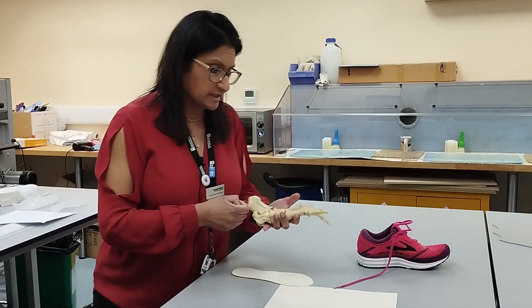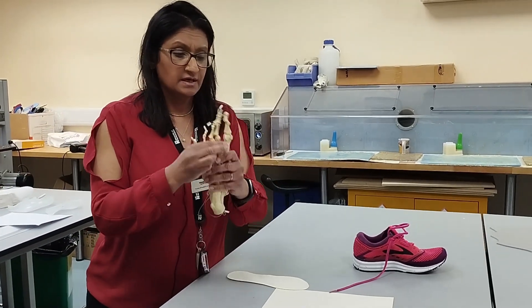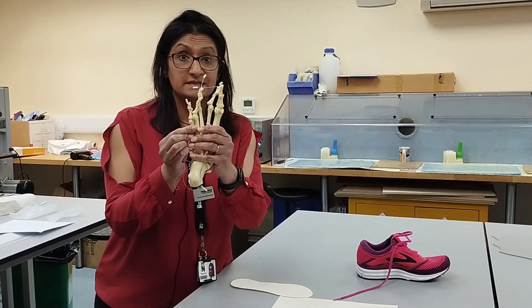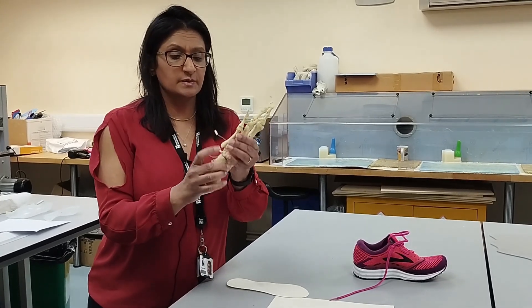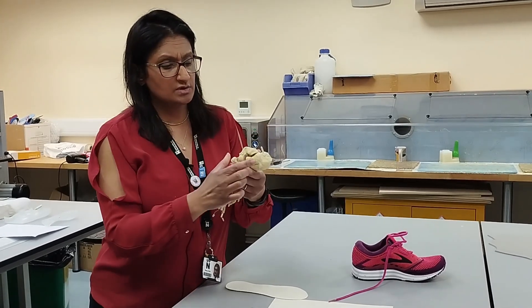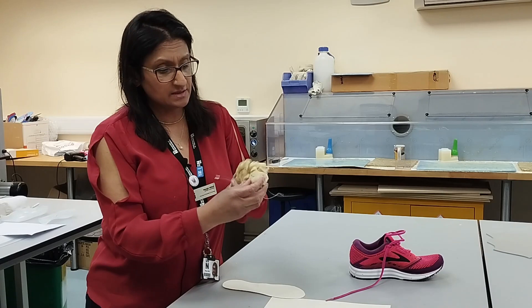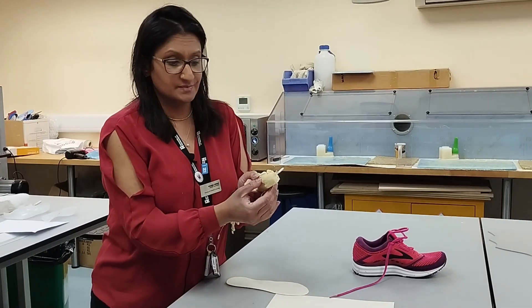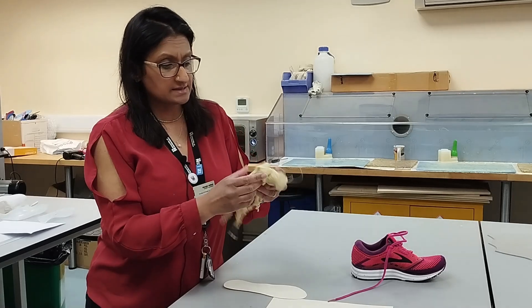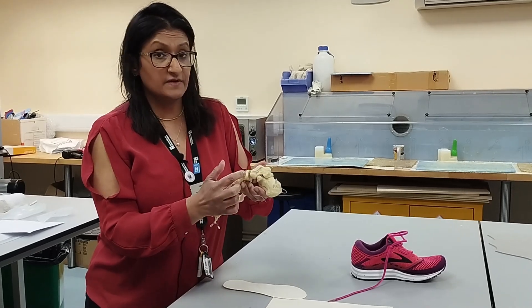Which marks are we going to be looking at? You're going to be looking at the first, second, third, fourth, and fifth metatarsal heads. You're going to be looking at the styloid process, which sits here. You're going to be looking at the medial tubercle of the calcaneus, which is quite far back. And also you'll be looking at the talonavicular joint.